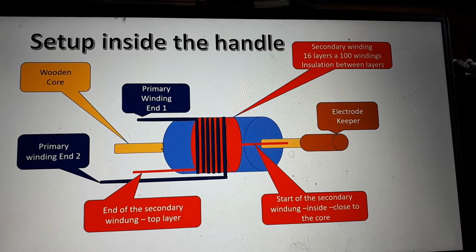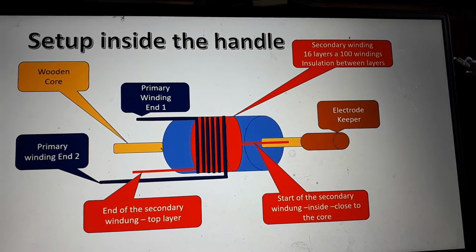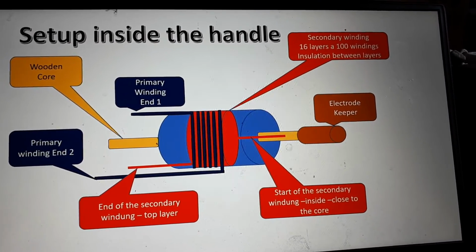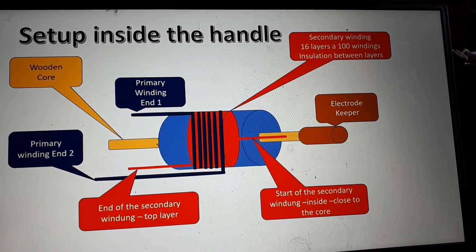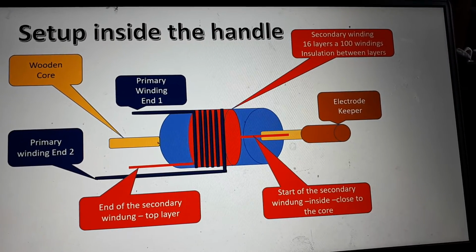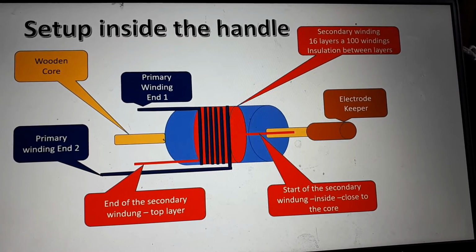The primary winding also can be part of the problem, because if the isolation there is damaged, there could be the same effect. But this is something that you can measure easily. You contact your measuring device at the two ends of the primary winding, and then you see if there is an energy through flow or not. And also, normally the measuring device can show you a kind of frequency and a resistance for this primary winding. So this can be easily checked, whether this winding is working.